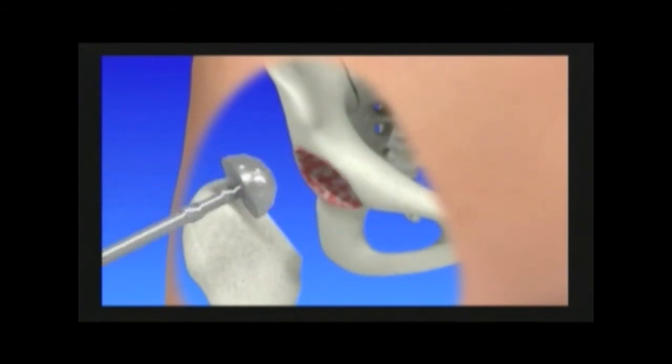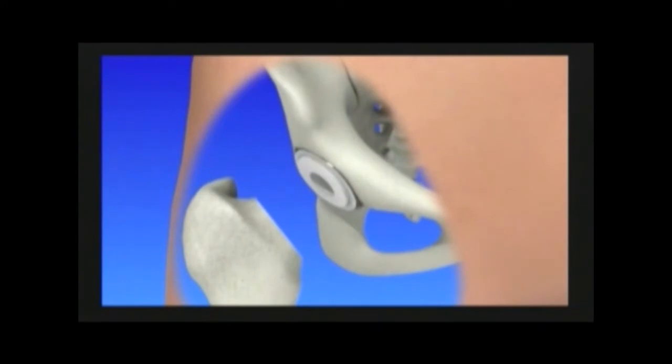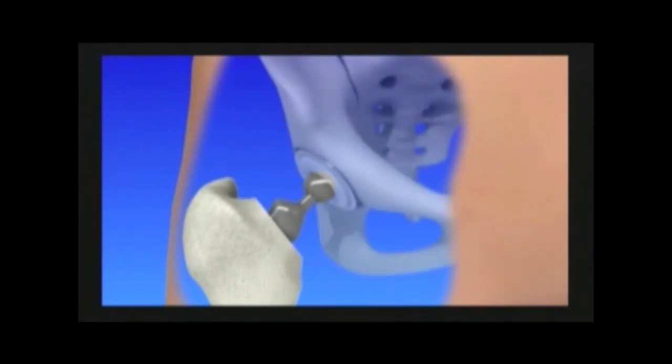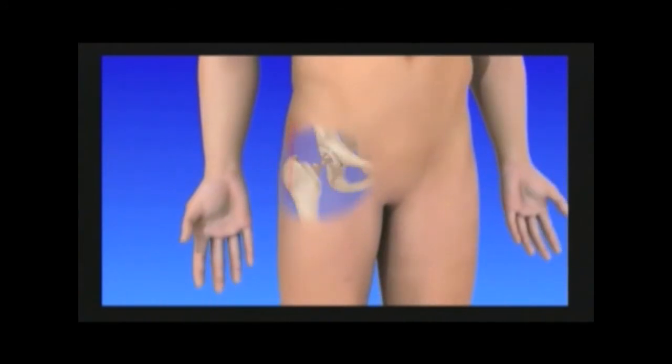Damaged cartilage and bone is removed from the socket. The implant is placed and may or may not be secured with surgical screws. The second implant is placed into the thigh bone and may or may not be secured with surgical cement. The artificial ball of the hip is then secured on top of the implant. The wound is then closed and a sterile dressing is applied. We actually split some muscle fibers, but we don't actually have to cut muscle.